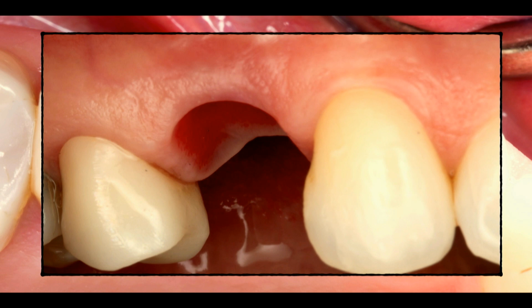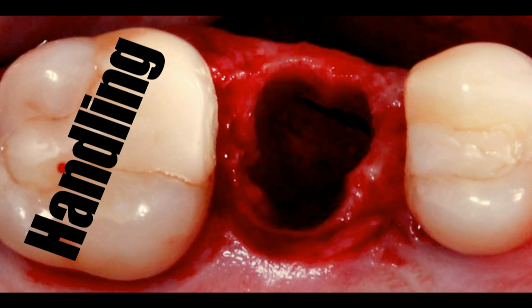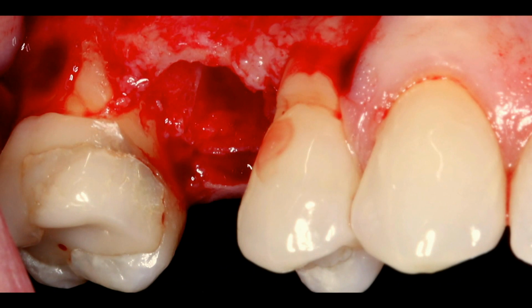So again, just trying to do things minimally invasive works really well with this membrane because it does suck down over the defect very, very well. The handling properties of this membrane, obviously, for those small areas work really well, but for these larger defects, there also is a huge advantage to using this type of a material.